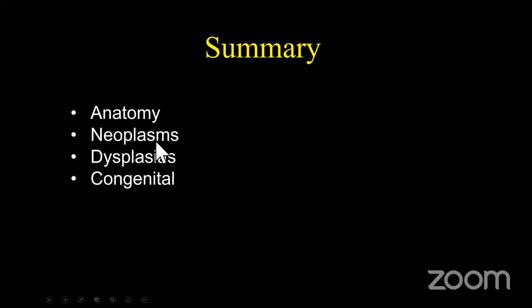We talked of a variety of neoplasms. We talked about dysplasias, a few congenital lesions. And my last two take-home messages are, number one, if you're going to look at thin structures and thin nerves, make sure you do thin section imaging. And number two, we as radiologists are your partners.